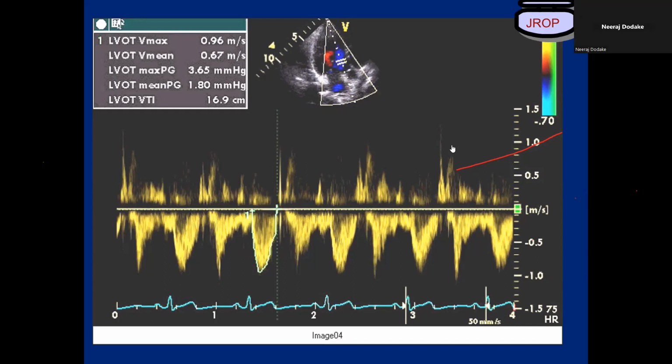Okay. So another question is, when you say that we have to decrease the gain or increase the gain, it might be a very basic question, but how to do that and what do we get from it? Gains of 2D image or gains of color? The gains of 2D image.